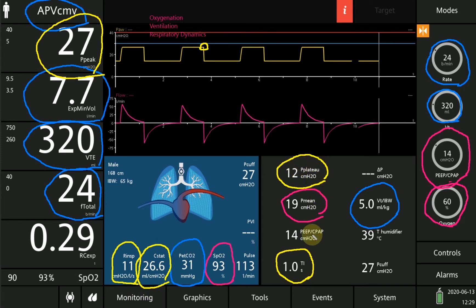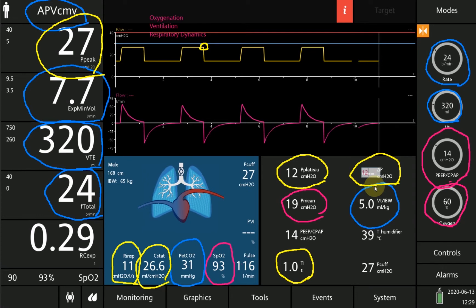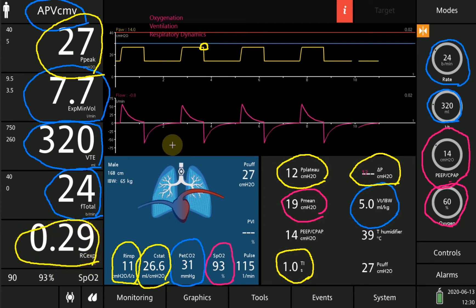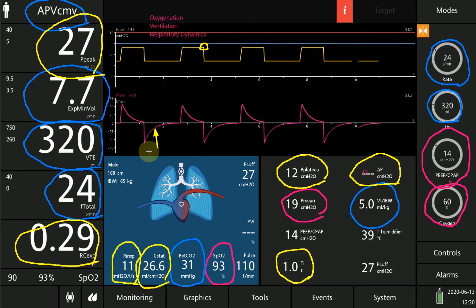The difference between plateau pressure and PEEP gives us the driving pressure. In this case, 26 minus 14 equals 12 cm H₂O of driving pressure. The time constant is calculated from resistance multiplied by compliance, in expiration. The value is 0.29 seconds, meaning the patient needs 0.29 seconds to exhale two-thirds of the inspired air. This time constant is decreased in ARDS and increased in severe airflow obstruction or asthmatic patients.